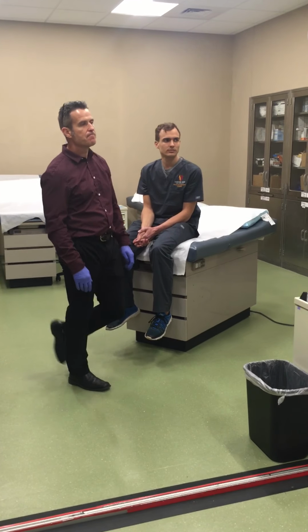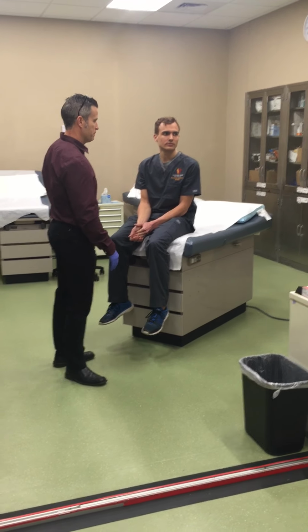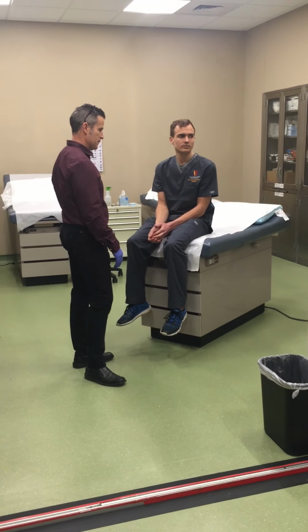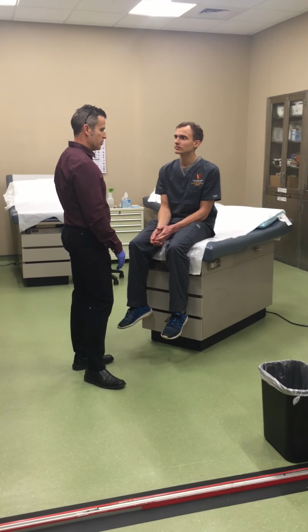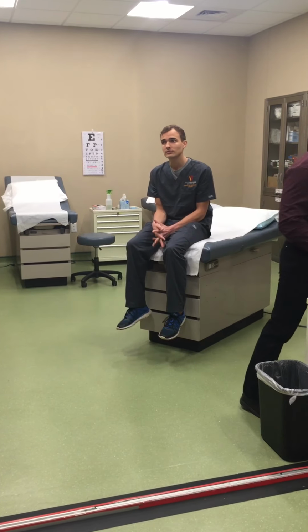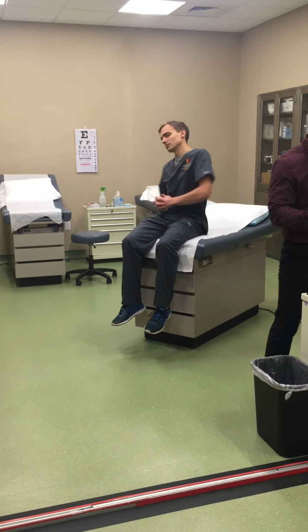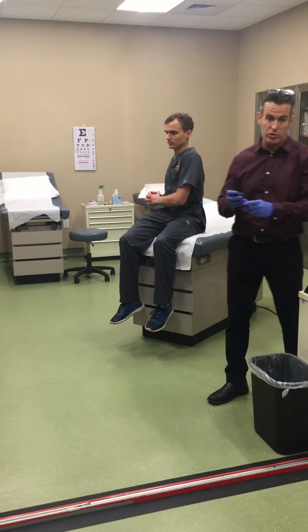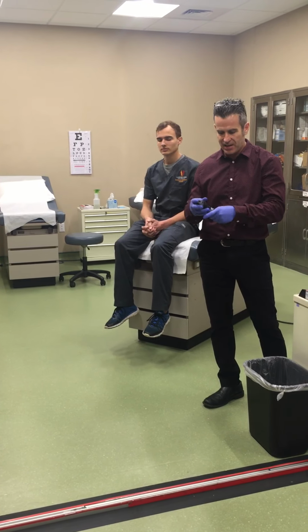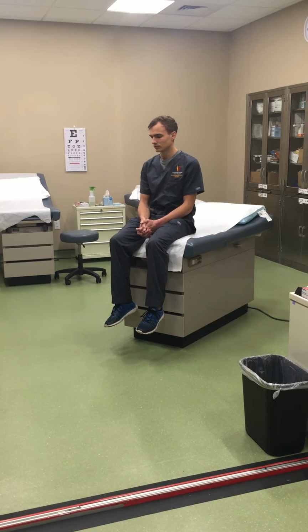Okay? So now you'll move on to the fundoscopic exam. So you'll verbalize, I would dim the room light before the fundoscopic exam. So yeah, it's going to be a little bit hard with those glasses over there, but I'll show you anyway. You want your room to be dark except for just a crack in the door so you don't stumble in the room. Okay? So when you do this on skills day, open that much is sufficient with the light off.